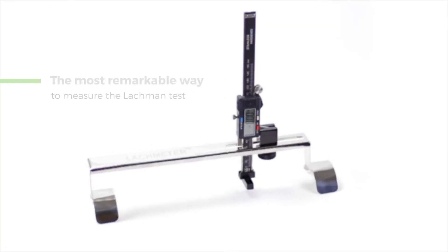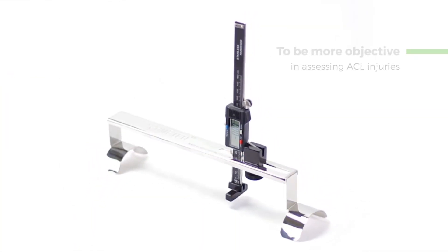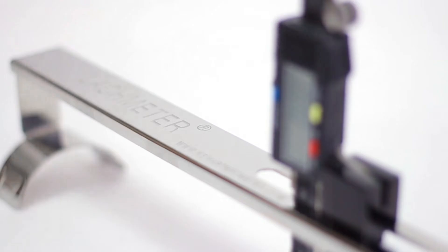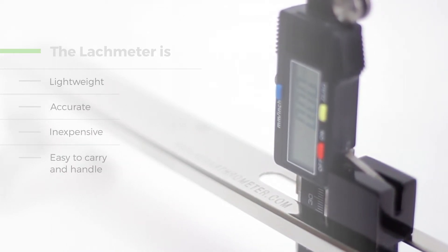Get to know the most remarkable way to measure the Lachman test. To be more objective in assessing ACL injuries, no heavy or complex equipment is needed. The Lachmeter is lightweight, accurate, inexpensive, and easy to carry and handle.